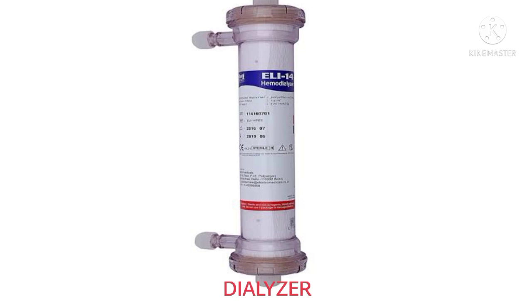Once the fistula or graft is placed and ready for use, two 15 to 16 gauge needles are placed in the access at each dialysis treatment. A pump pulls arterial blood out by way of the fistula and into the hemodialyzer. Blood returns to the client by a tube connected to the other needle. Alternatively, single needle dialysis may be used. With this device, only one puncture is required at a time, but there may be recirculation of dialyzed blood, meaning that clearance rates are decreased. Internal arteriovenous graft may cause hand swelling or ischemia, carpal tunnel syndrome, hemorrhage, thrombosis, and aneurysm.